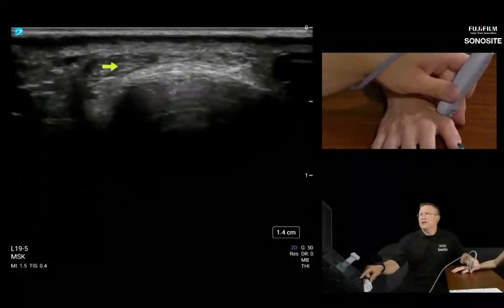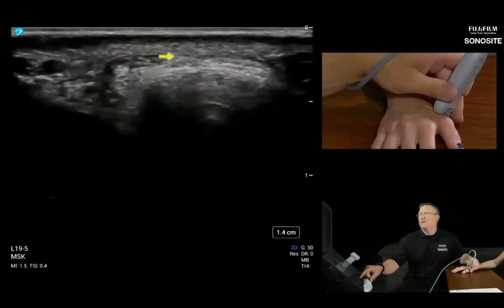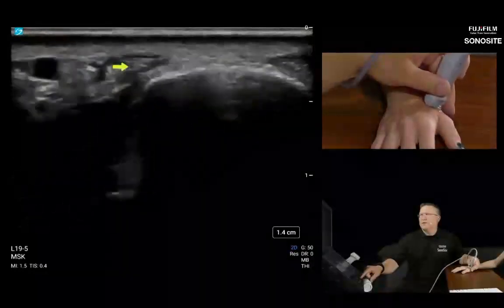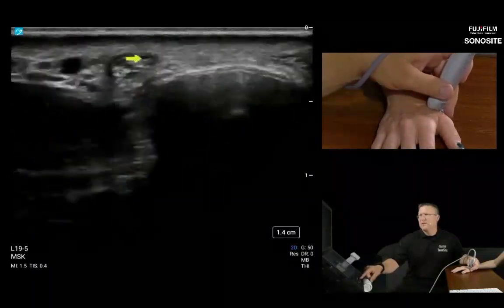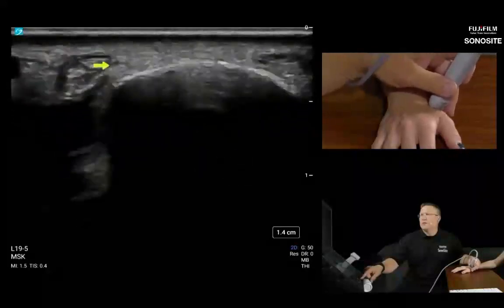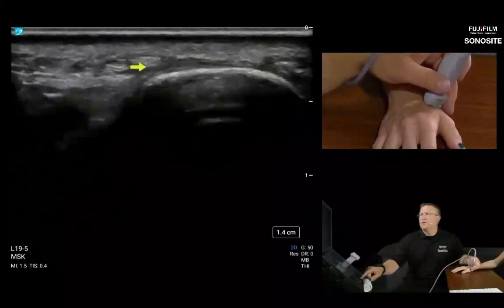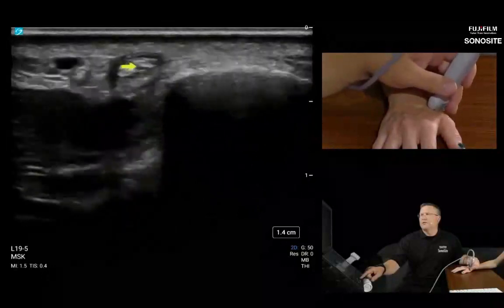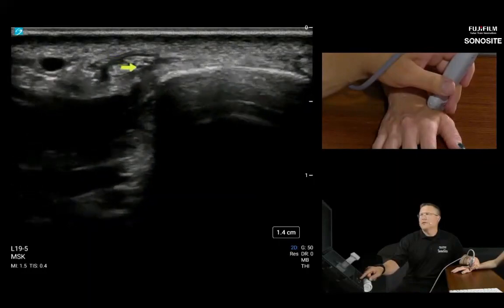Again, I think at 19 megahertz, I'm still seeing two individual ovals, one here and one here. I haven't studied whether or not there's two heads to this tendon, but it definitely seems like there is. So we'll have to take a look at that. Maybe ask some of you physician experts that have joined the webinar if that's some sort of variant, or if it does split into two normally. But on normal frequencies, larger footprint transducers, we don't notice those subtleties. So I just thought it was neat to point that out. I definitely see one and two heads here with a little septum between the two.